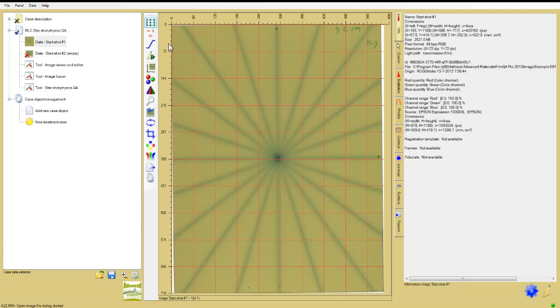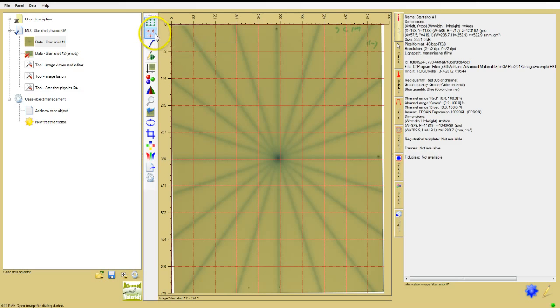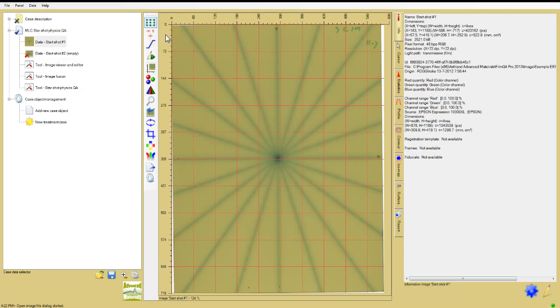The next step is to use the fiducial management tool on the image window toolbar to highlight marks on the film, indicating the central beam axis and the transverse axis of the linear accelerator.